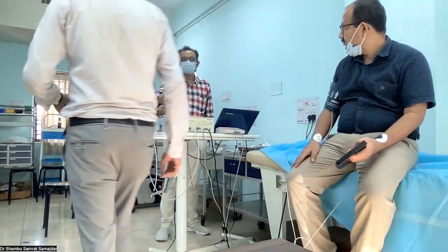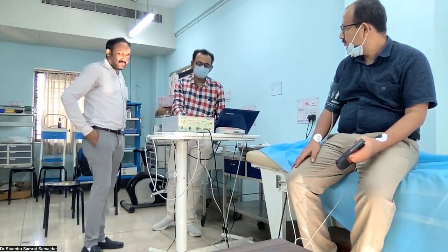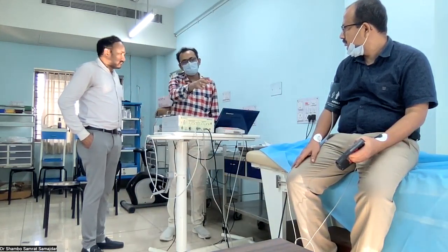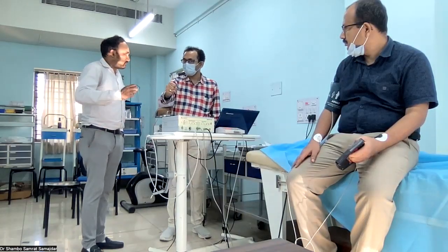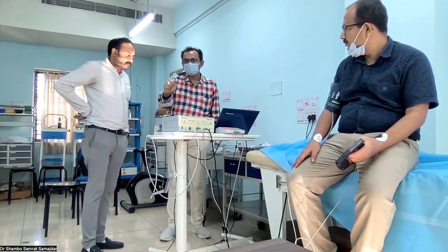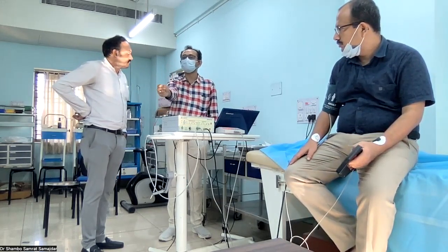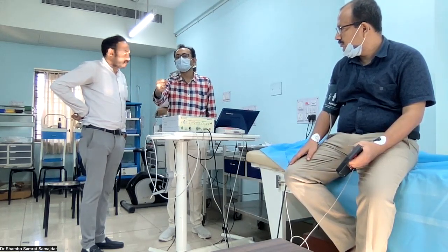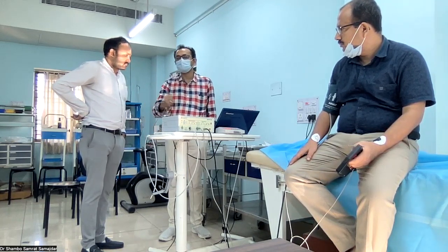Here a little correction is needed. According to this machine we are doing it this way, but actually in the sustained hand grip test, we need to ask the patient to give the maximal isometric exercise pressure, and after that we calculate 30% of that, and ask the patient to hold at 30% of the maximal pressure for at least 3 to 5 minutes. Many patients will get tired and the muscle will be fatigued, then we can ask them to stop.